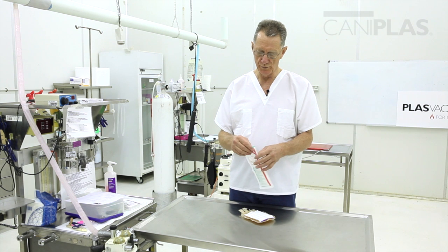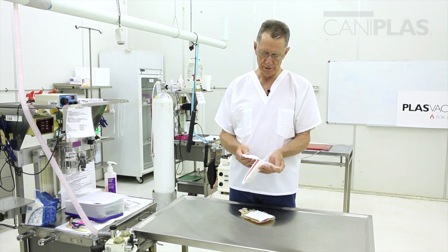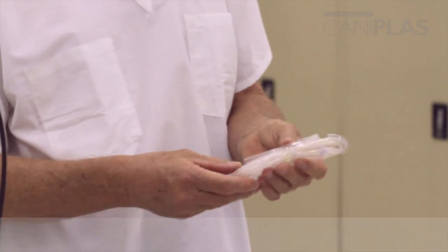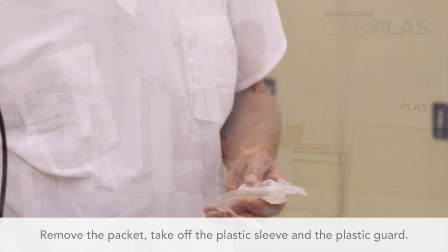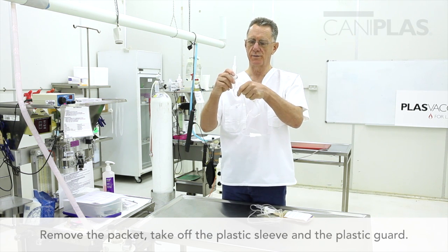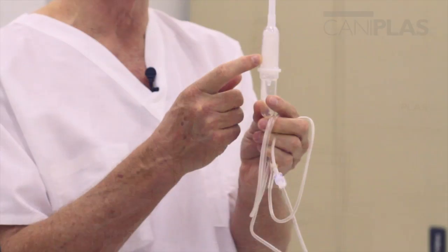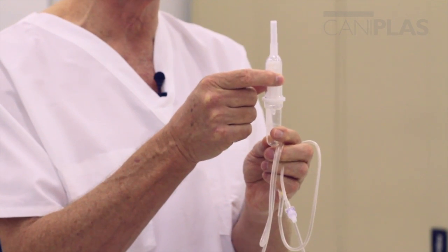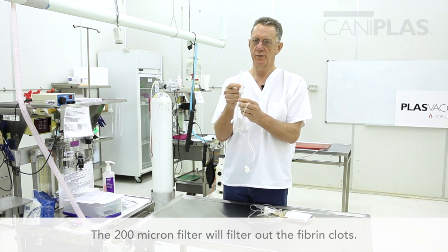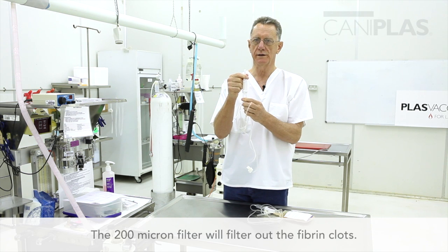Now I'm going to remove the Sangofix ES from its packet and demonstrate some salient features. First we take off the plastic sleeve and the plastic guard. This is the drip chamber, this is the 200 micron filter — that's what's going to filter out any fibrin clots or particles. And this is the sterile transfusion port.